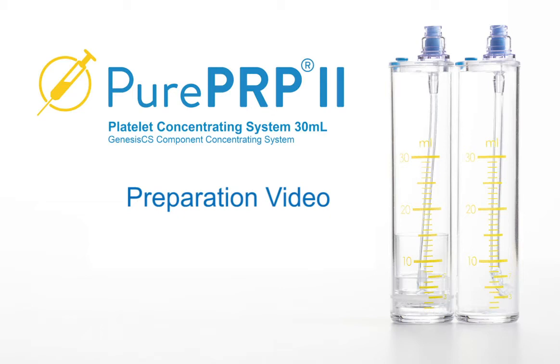Welcome to M-Cite's Pure PRP 30ml. This video provides the processing steps for the 30ml concentrating system.